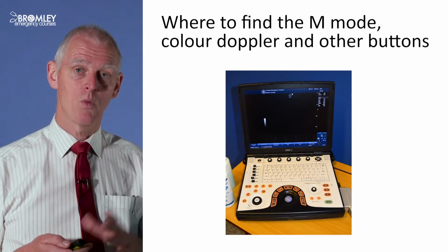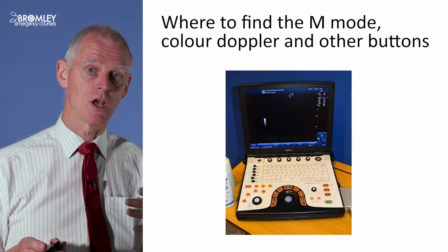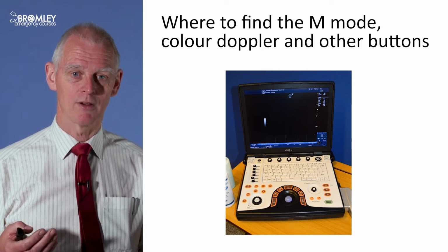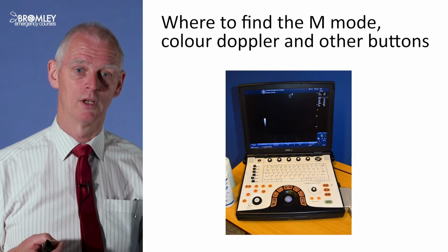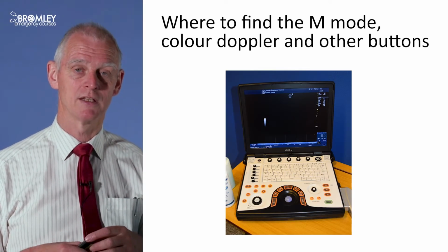So those are our second order controls. We've talked about M mode and about TGC and about Doppler functions and about focus. So where are these buttons on a machine? Well, they vary. These machines are machines with the traditional hard buttons, and they're often scattered around. Here's a series of them here. Here's the Z6, a Mindray machine. You see a number of them above the trackball. And on this older Sonosite, there's a number of them over on the right-hand side.